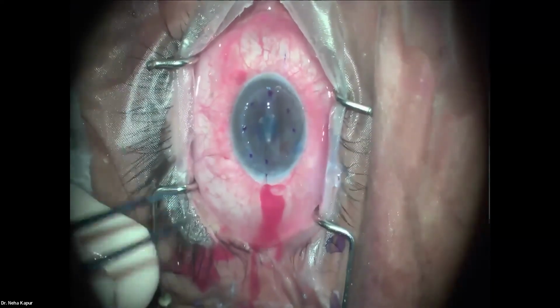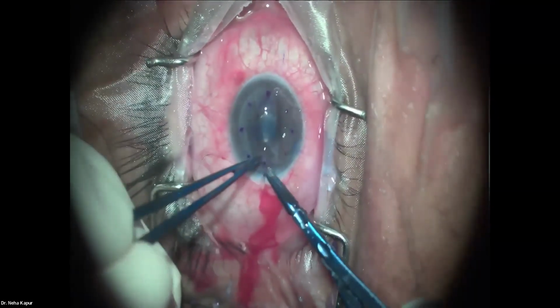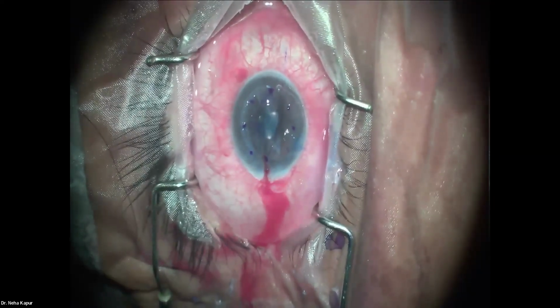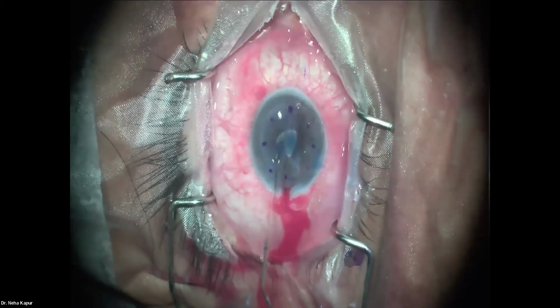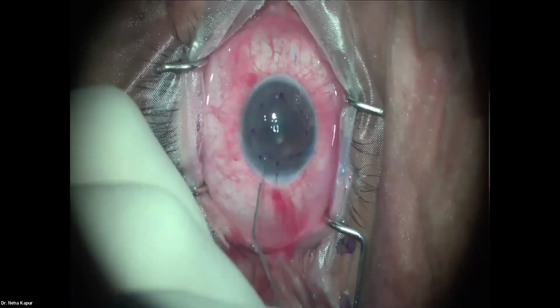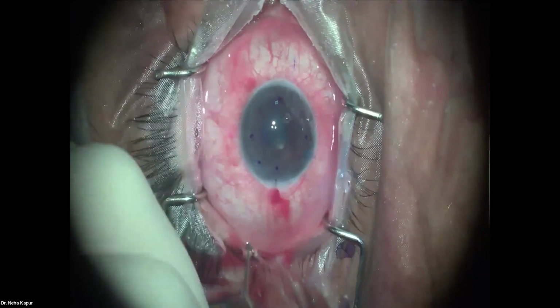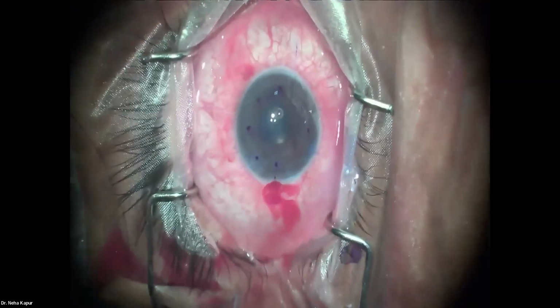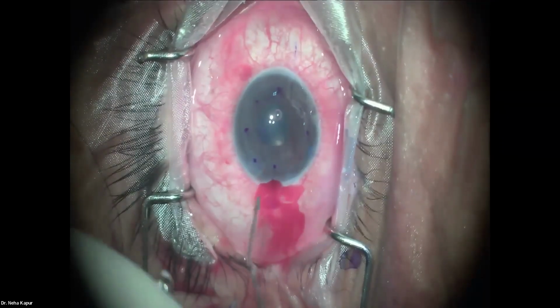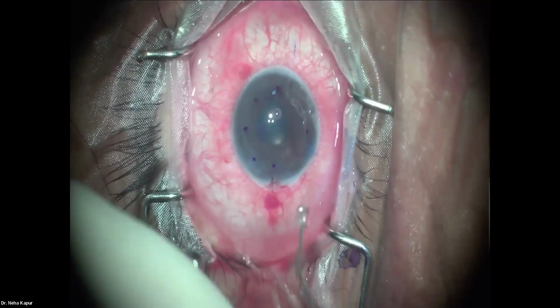As we can see, there's a little fold in the tissue, but that's immaterial. We will unfurl it now once we put hydro in the eye. Hydro. So we put in some fluid, and as the chamber forms, you see that the tissue opens beautifully inside the eye. If you can see the letter F, we can see very well, which shows that the tissue is in the right orientation. And thus, that is very important to have.